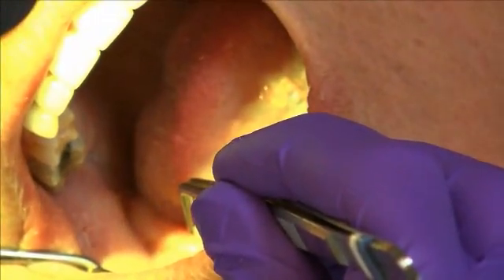Place the post in the root canal filled with cement. Apply moderate pressure to hold it in position. We recommend rotating the post slightly during insertion to avoid the inclusion of air bubbles. Light cure the cement for 40 seconds, or allow to self-cure for 5 minutes from start of the mix.